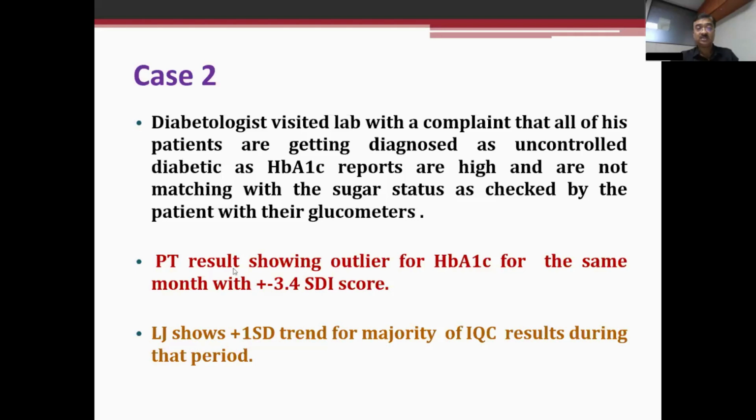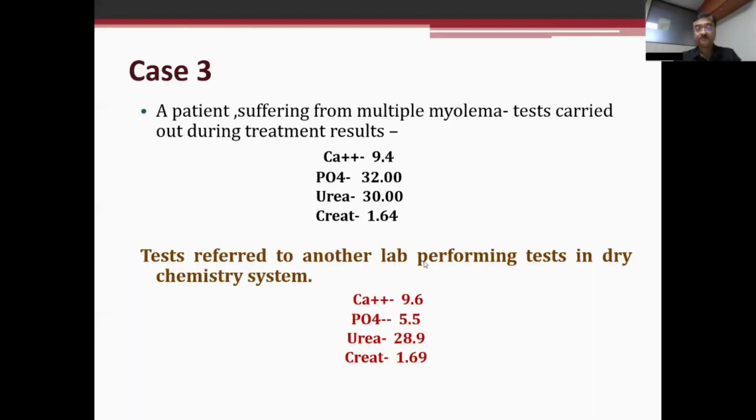So this is a typical error, or you can call it an analytical error, when there is a problem with some calibration of the instrument and there was an outlier in accuracy, outlier in precision, showing constantly there is a systemic error which has been ignored until I got the complaint.